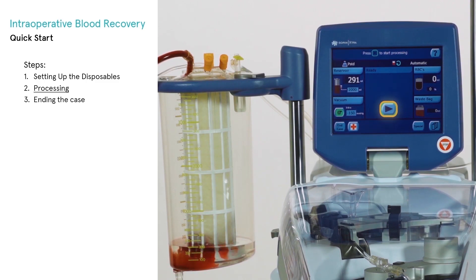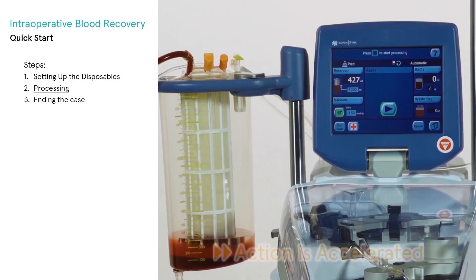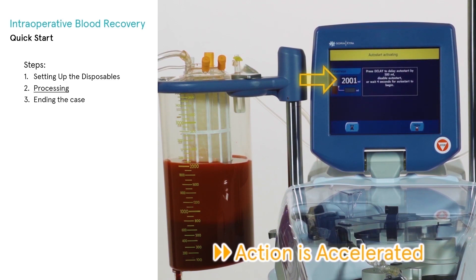The fill phase will begin processing automatically once the reservoir contains the programmed auto-start volume. If auto-start is not active, press the play key to initiate processing when the desired amount of blood has been collected.